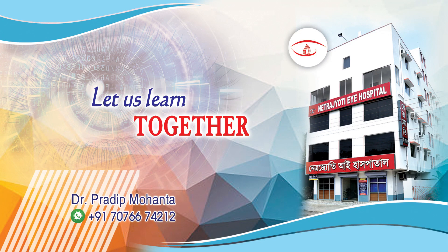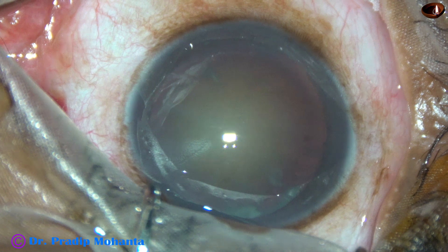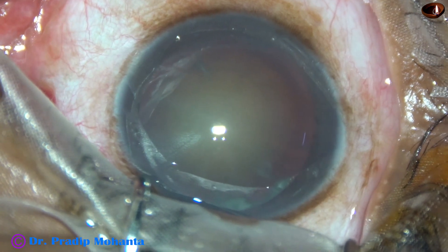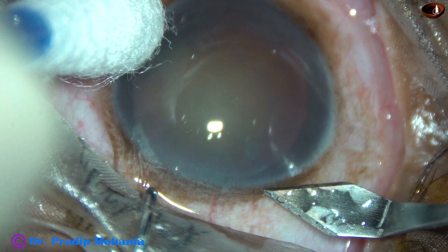Friends, welcome to my workplace at Ranaghat, West Bengal, India. This is a cataract with grade 4 nuclear sclerosis and the eye is deep-seated. Let us observe this surgery.